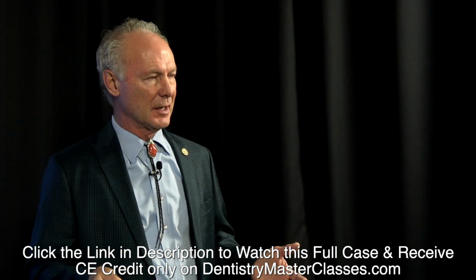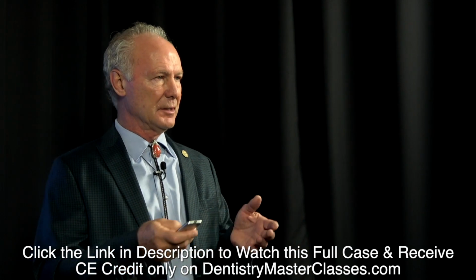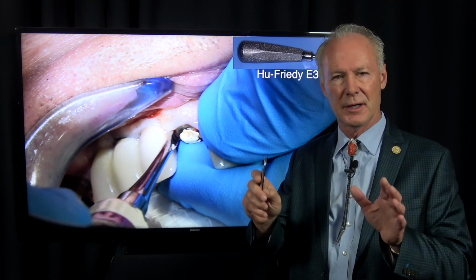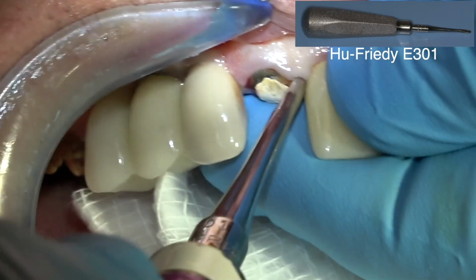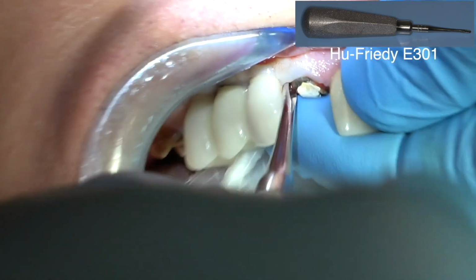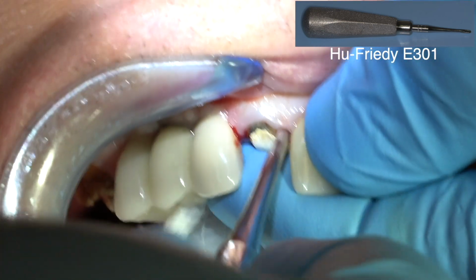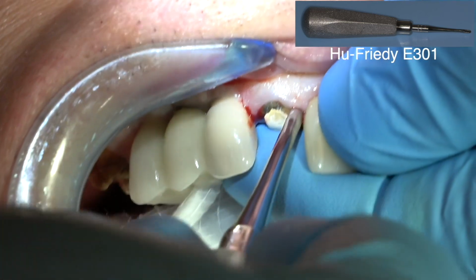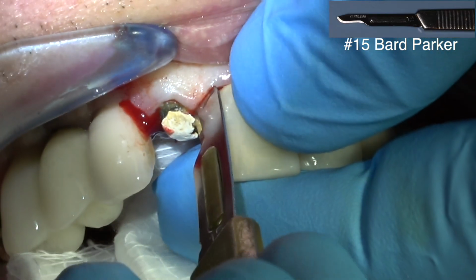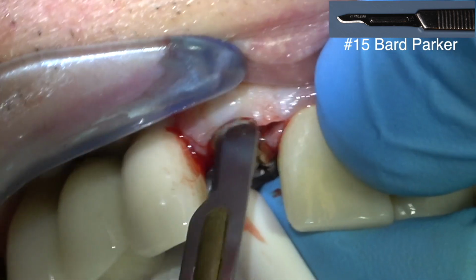I graft the socket ideally with platelet-rich fibrin mixed with freeze-dried bone. I like to mix it with some freeze-dried bone because the platelet-rich fibrin is kind of like working with Jell-O. Freeze-dried bone gives it some stability, more like sand, but you've got the enhanced healing effect of the platelet-rich fibrin, and the platelet-rich fibrin serum is used to mix with the freeze-dried bone and the cut-up pieces of the platelet-rich fibrin. So see, I'm trying to get just a little bit of mesial distal movement on that lateral incisor.